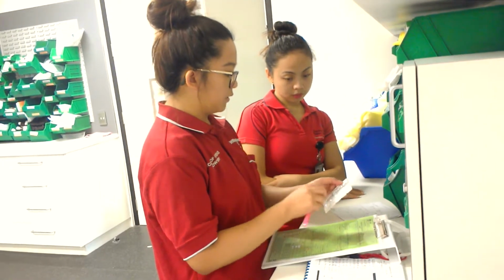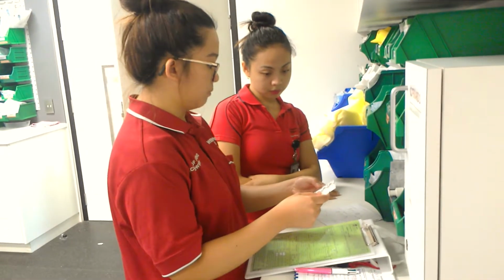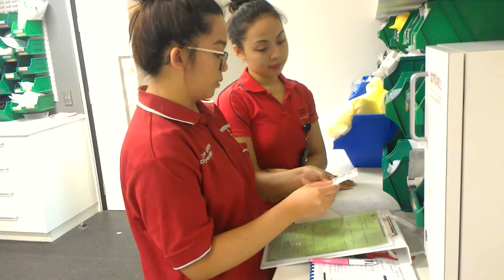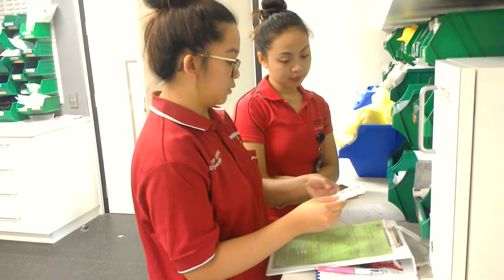And so I've got morphine sulfate 10 milligrams in 1 ml, morphine sulfate 10 milligrams in 1 ml, morphine sulfate 10 milligrams in 1 ml, morphine sulfate 10 milligrams in 1 ml, and the last vial, morphine sulfate 10 milligrams in 1 ml, all with the same expiration date of October 2020.